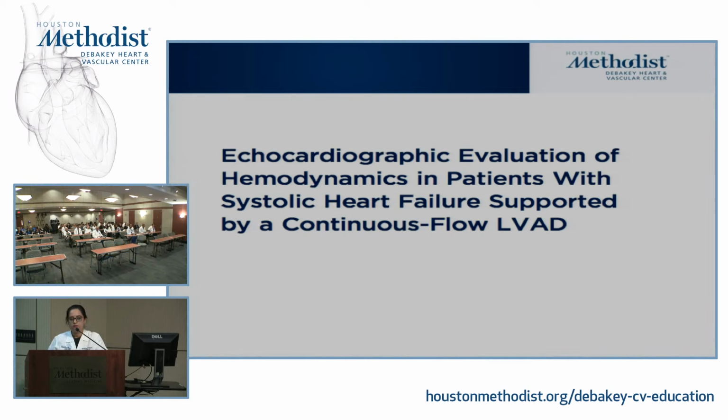Right. Because if you click, it's going to come out as a report of hypertension. And in this situation, it may not be. Right. It may be excessive overloading. Yeah. So we have to be careful when we write that statement. We don't use the traditional statement that will say RV systolic pressure. Right.